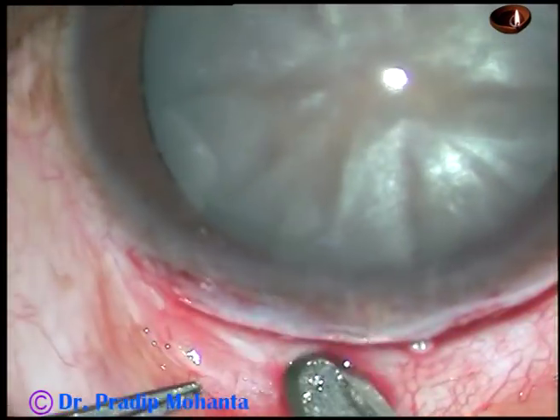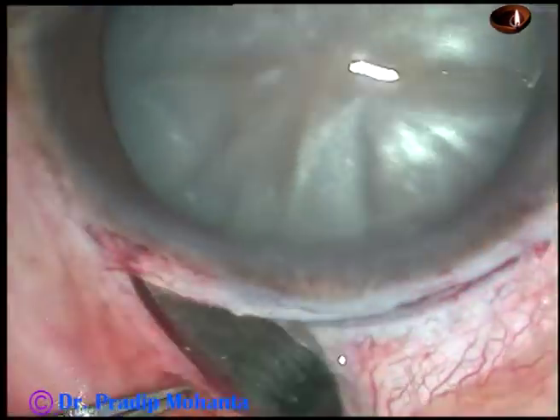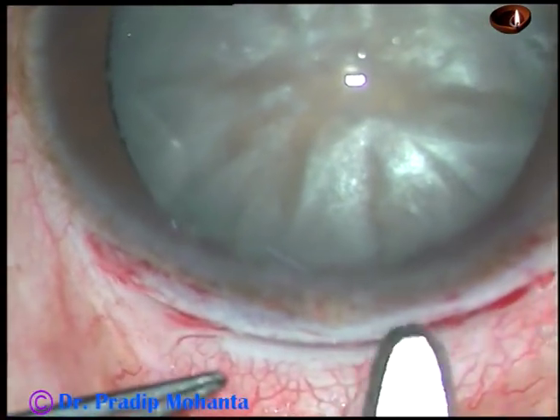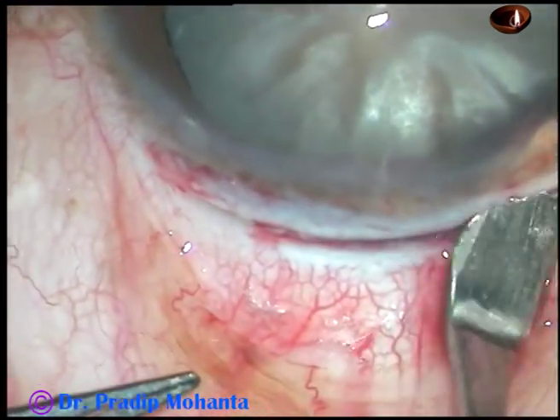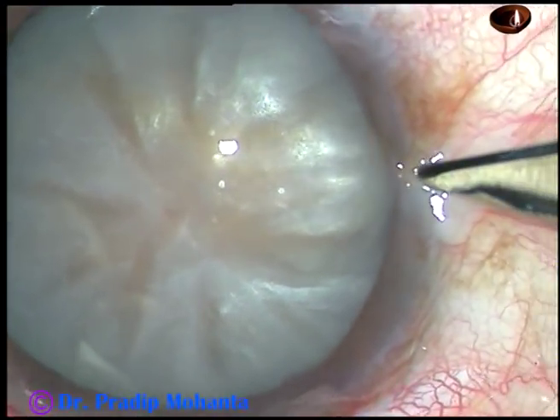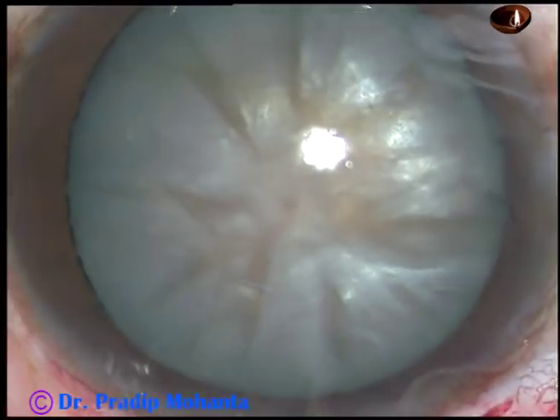This is a 2 mm wide and about 10 mm long entry. Now make a side port at around 9 o'clock.